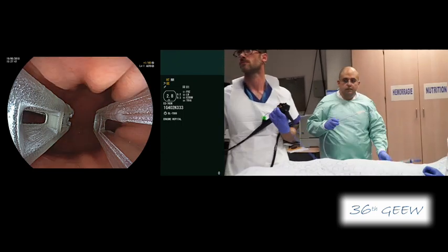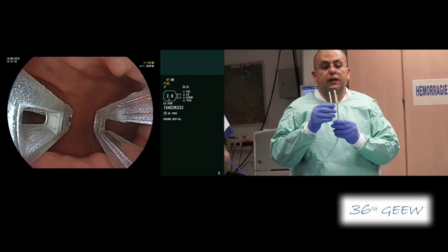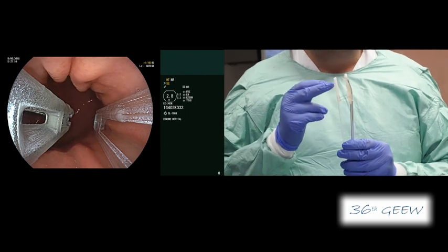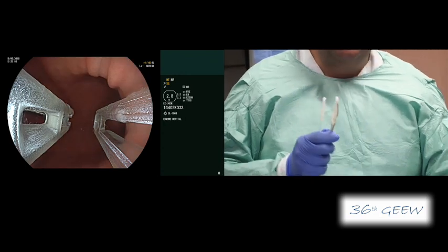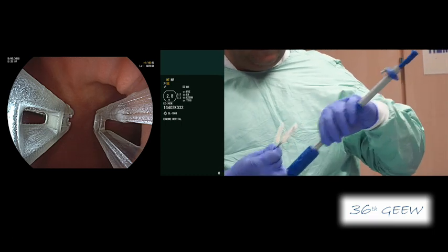The device, as you can see on the endoscopic image, is an over-the-scope device that accommodates any endoscope. It has two arms: the straight arm with a window inside, and on the other side the bending arm. This bending arm accommodates an already pre-loaded needle.